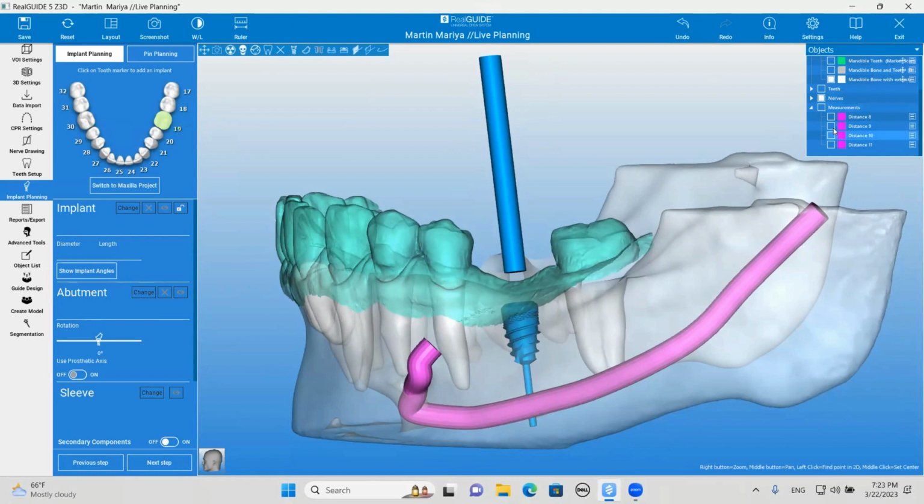So by doing those guide planes, like Hussein showed you with those 2 lines, you'll have a long contact area and less chance of that contact opening up. Usually contacts open up because of mesial drift, which happens in older patients. Again, this patient doesn't have the best quality of bone, so these teeth can move a lot easier than in someone with much denser bone.